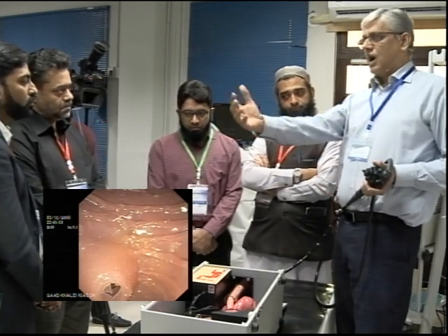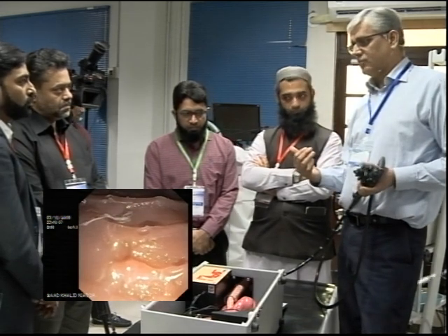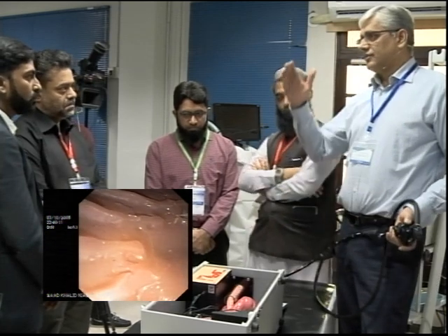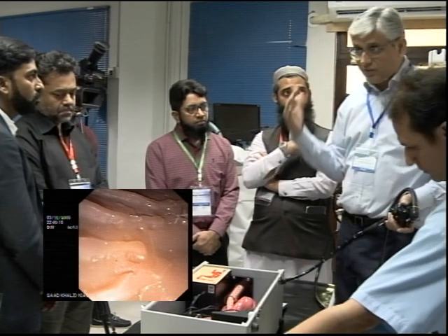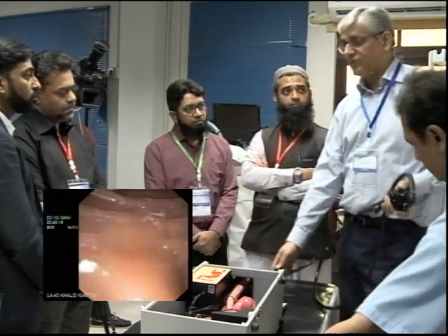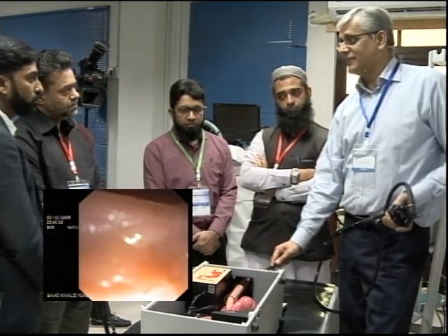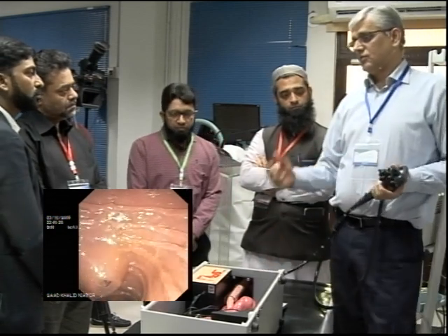Important to know, how do you bring the ampulla close to you? Like you said, big wheel, pulling back, and this. When you're stuck with difficult stenting and you're not getting through, all three have to be applied at the same time, and you can do that. So the big wheel is bringing this here, you're pulling back at the same time, and you're going this way. Okay?